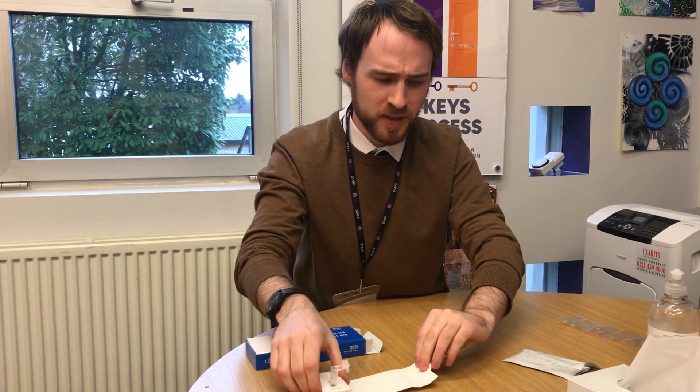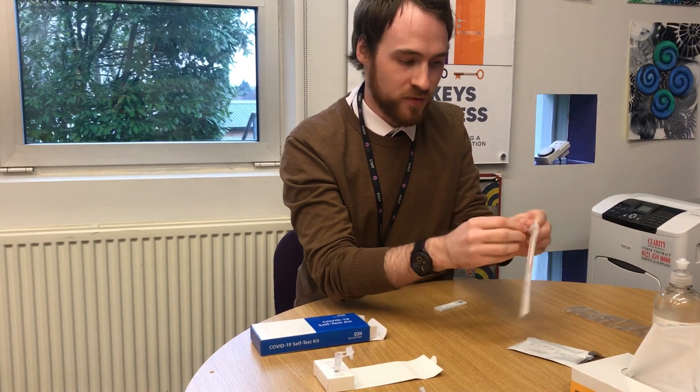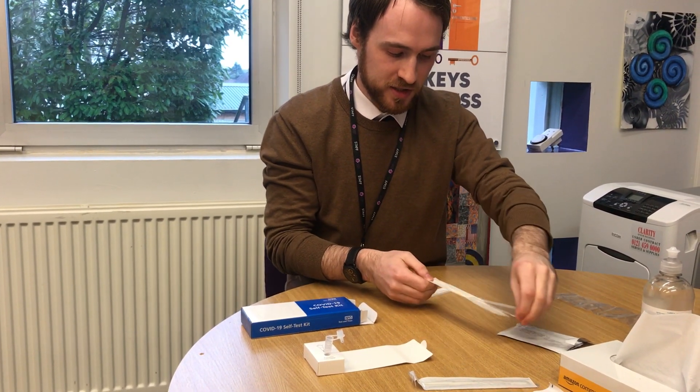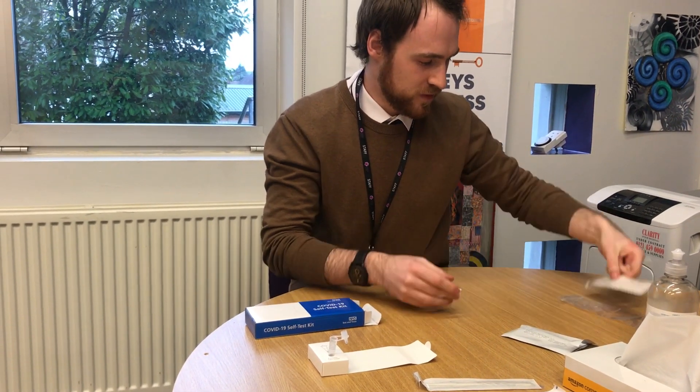Now next is probably the part you're most familiar with — the swab test. It makes it very clear where you should open it. Take the soft part of the swab and put it on the back of the tonsils four times on either side, then up the nostril two and a half centimetres. If the child can't do a nostril test for whatever reason, the tonsils alone will do. On the way out of the nostril, just gently revolve it around the rim of the nostril, and then we're done.